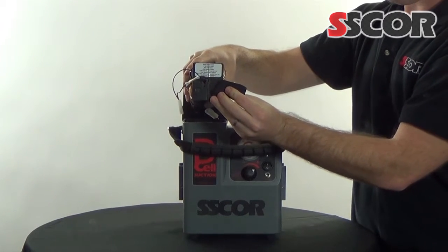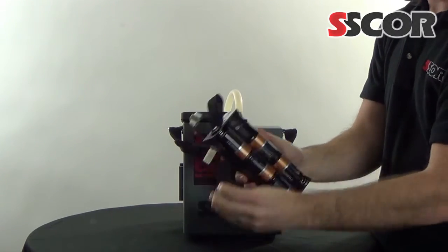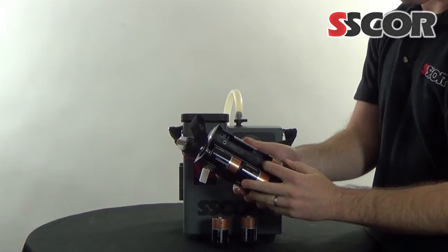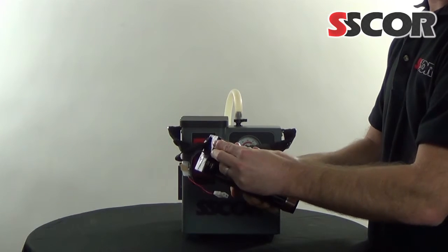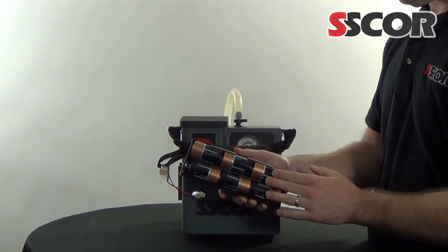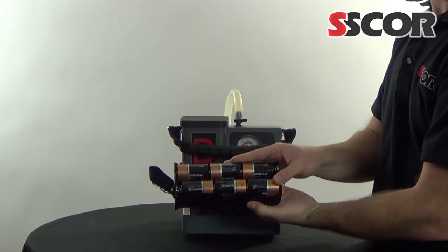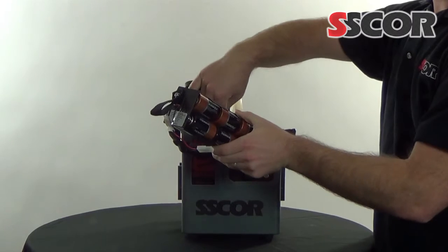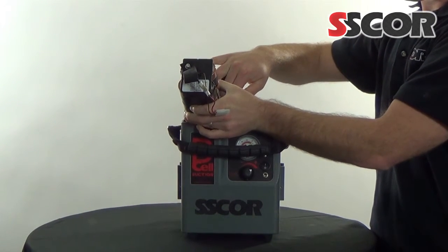If replacing discharged batteries, remove them from the 12x DCell battery holder assembly and dispose of them according to local, regional, or national requirements for the disposal of alkaline batteries. Install 12 new DCell alkaline batteries into the 12x DCell battery holder assembly. Be careful to assemble the batteries in the correct orientation, as indicated on the battery holder assembly. When the battery holder assembly is loaded with 12 new DCell alkaline batteries, set the 12x DCell battery holder assembly back into the chassis.